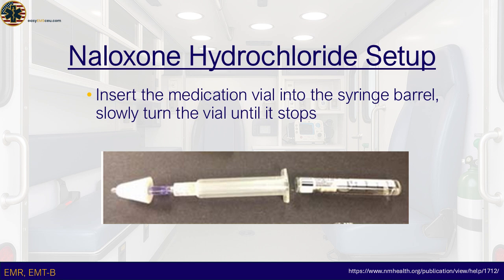Be careful not to over-tighten, as this could damage the threading or make removal difficult later. Once attached, double-check that the connection is stable and that the medication is ready for administration without any leaks. Maintaining a steady and gentle turning motion helps prevent damage and ensures proper alignment of the components.